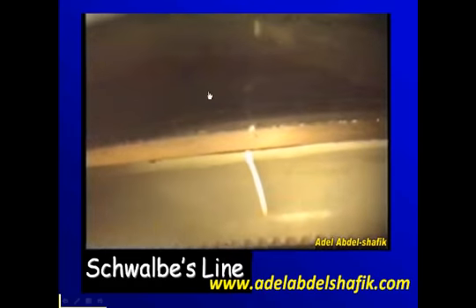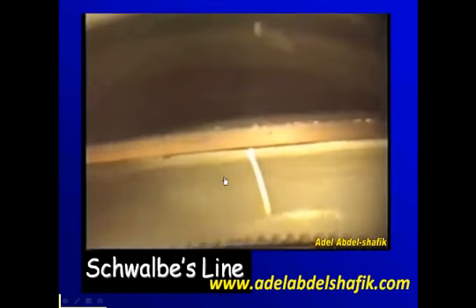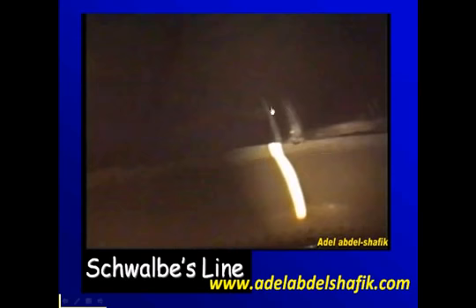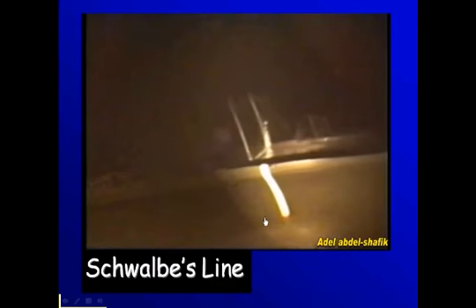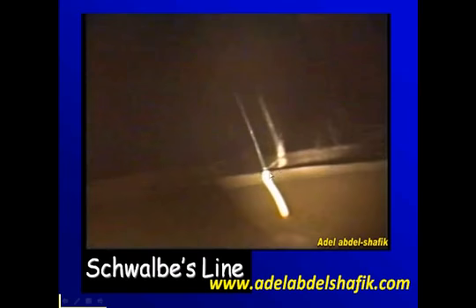This is the light of the slit lamp. Up here you have the cornea, and down here you get the opaque sclera. As you notice here, you can see a section in the cornea. This is the inner surface and this is the outer surface of the cornea, and in between you get the stroma. While down, you only get the inner surface of the sclera because the sclera is opaque. So this is the location of the Schwalbe's line between the cornea and the sclera. And this is what you need to do on a slit lamp to locate the Schwalbe's line.